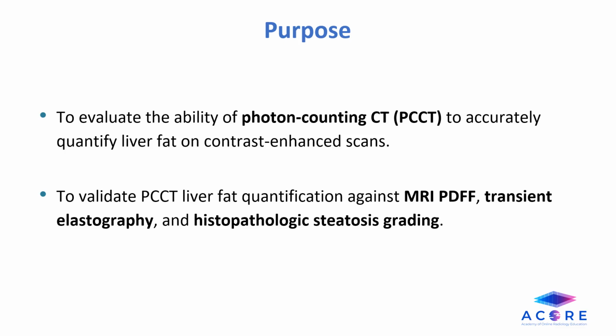So the goal of this study was to see if photon counting CT can measure liver fat as accurately as the trusted standards like the MRI, the biopsy, and the transient elastography, which is an ultrasound based technique.